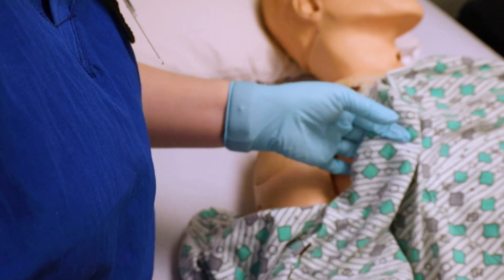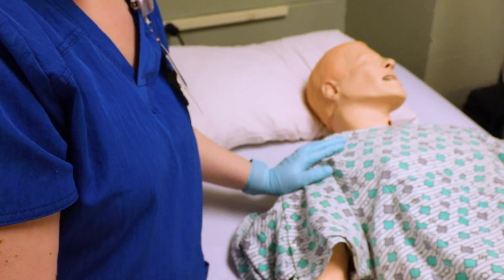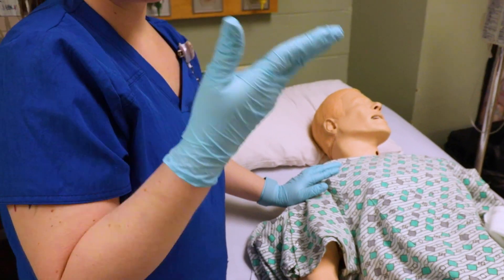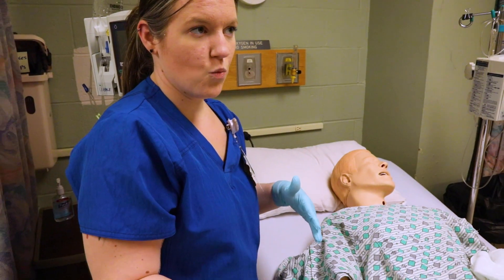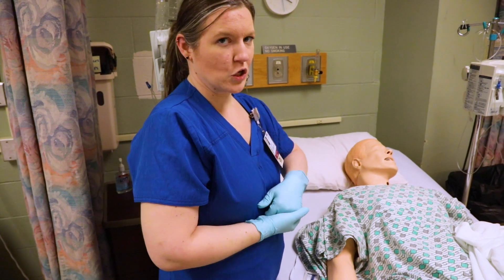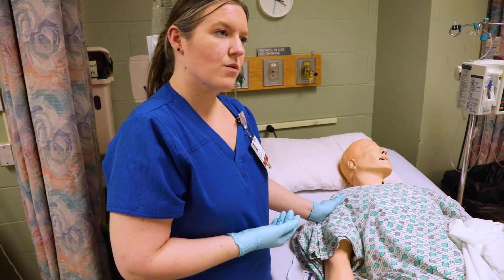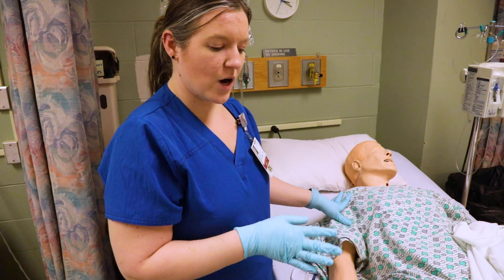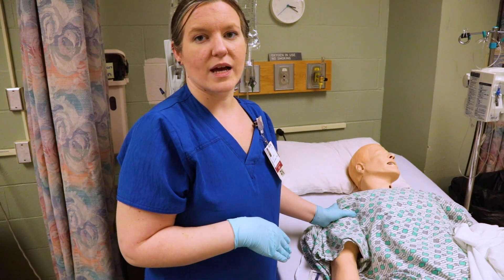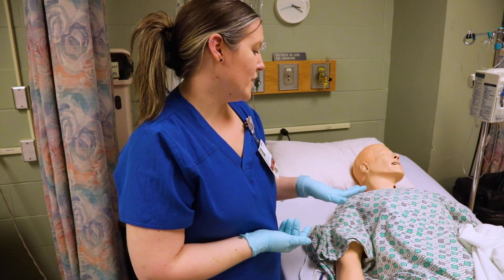For this intramuscular injection, make sure the needle is the appropriate size for the patient. Because intramuscular starts with an I, that makes me think of a one because an I looks like a one — so around a 21 gauge, could be a 23 gauge, depending on your patient. For the deltoid, you only want to give about one milliliter or under. That is pretty universal — you only want to do one milliliter in the deltoid.